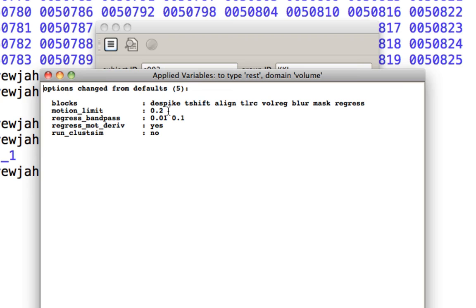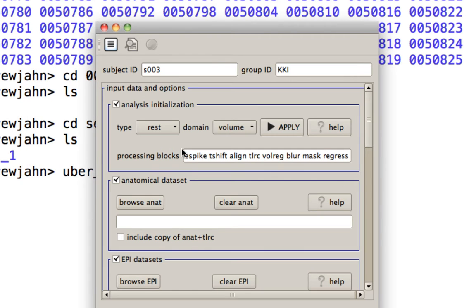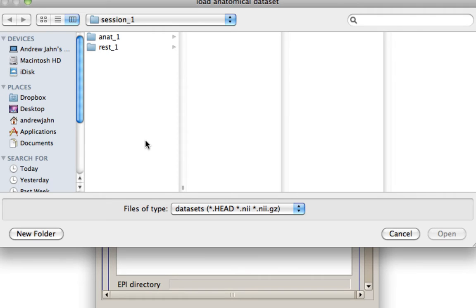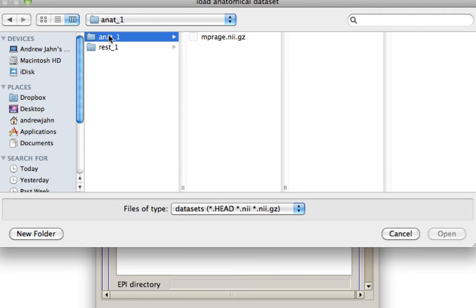Now it's up to you, if this means that you're going to be losing almost all your subjects, you might want to make this a little bit more liberal or increase it a little bit, but it's also going to put you at risk for more confounding effects. So it's really up to you. In this case, I'm going to leave it as 0.2. Everything else, all the defaults are pretty good.